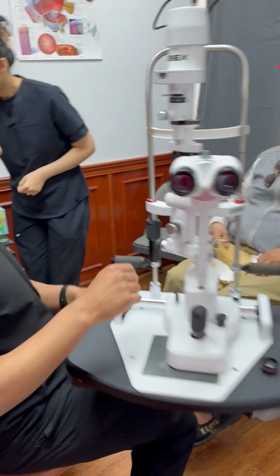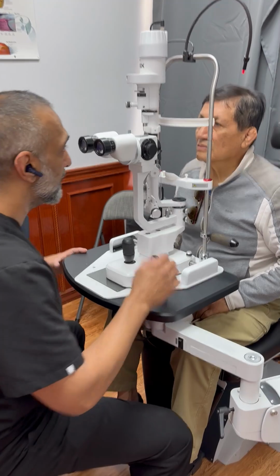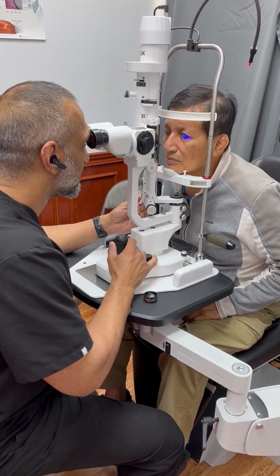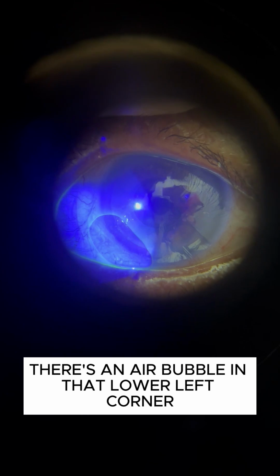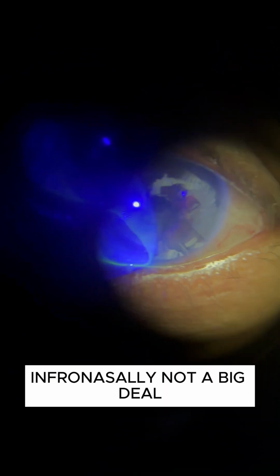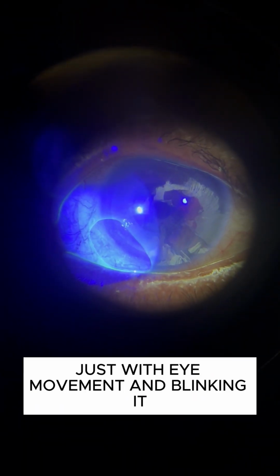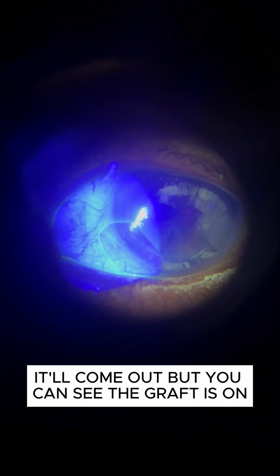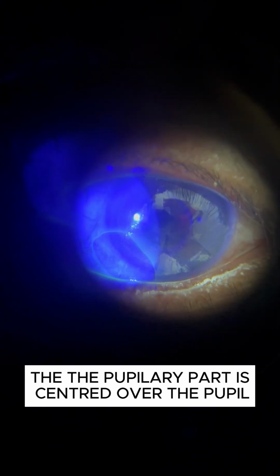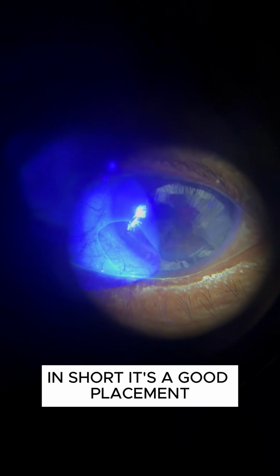Abre el ojo. Good. In short, the graft is on. There's an air bubble in that lower left corner, inferonasally. Not a big deal. Just with eye movement and blinking, it'll come out. But you can see the graft is on. The pupillary part is centered over the pupil. In short, it's a good placement.